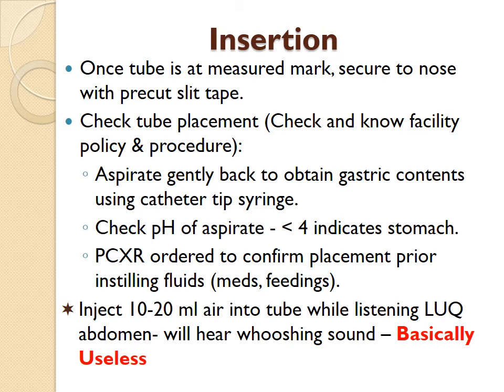But as I said before, your guaranteed placement will be the portable chest x-ray. Now, depending, as I said earlier, if it has been placed in surgery, it's been verified by the surgeon. They don't need another confirmation with another x-ray once they get to the floor. And the doctor will usually note in their orders that they placed it, everything was done, and the length of it, and it will be marked. So you just do not need to pursue further.